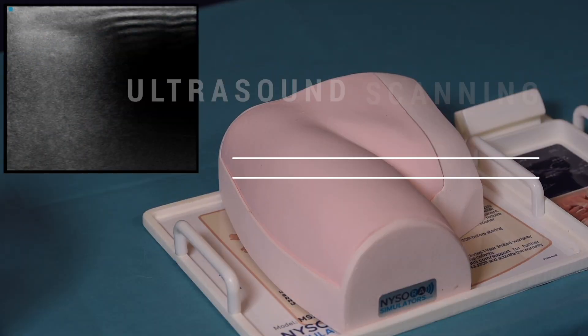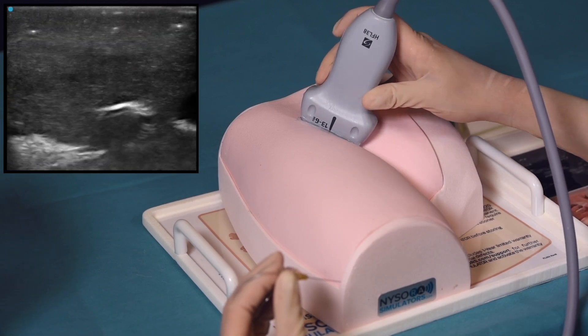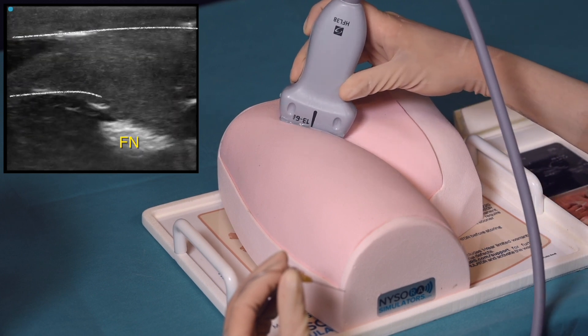To practice image acquisition and needle insertion for the femoral nerve block, the transducer is placed on the femoral crease. Here, the femoral artery, femoral nerve, fascia lata and fascia iliaca are well seen.